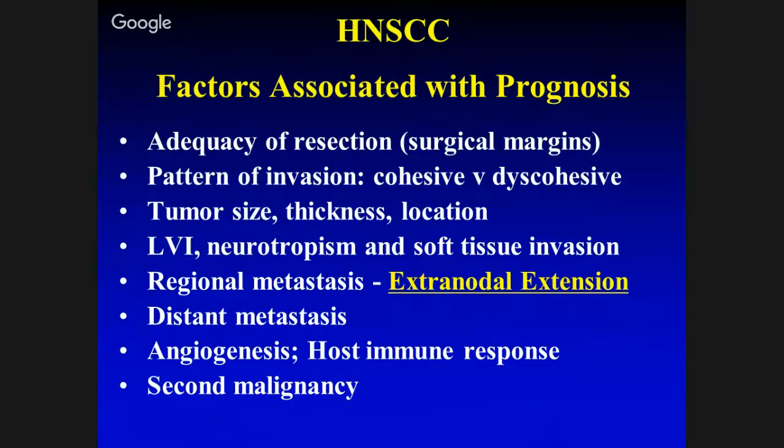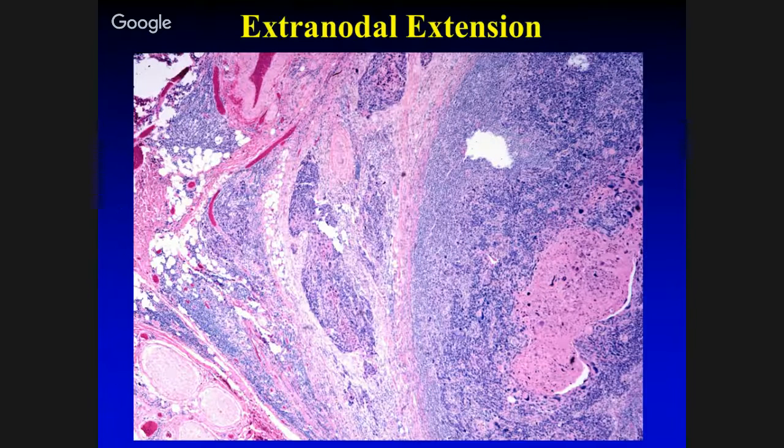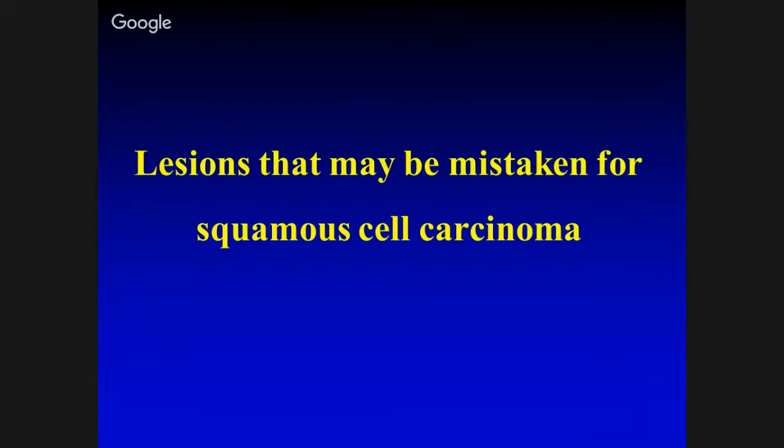Squamous cancers that have extranodal extension, like here. So here's the tumor, and this is in soft tissue. Those patients are at extremely increased risk of local regional recurrence and distant metastasis. And the surgical and medical oncologist will approach this differently. So here's another example where we play a significant part in how the patient gets managed. Okay, any questions to that point?